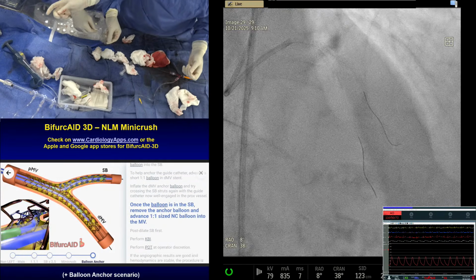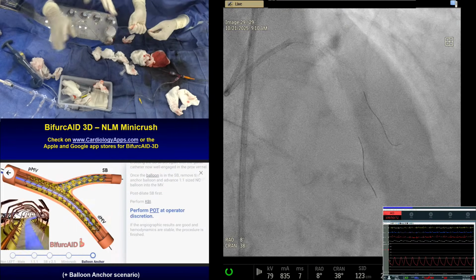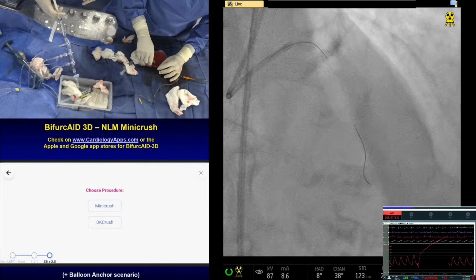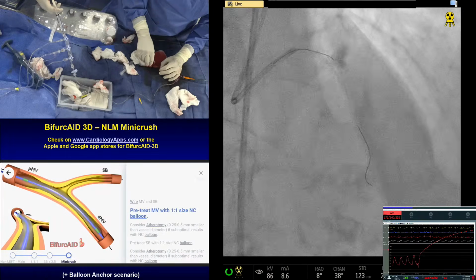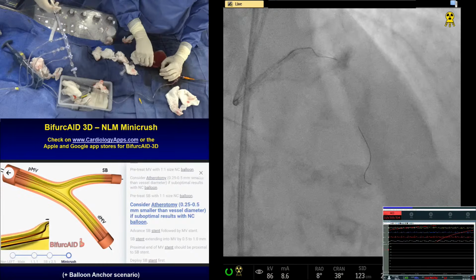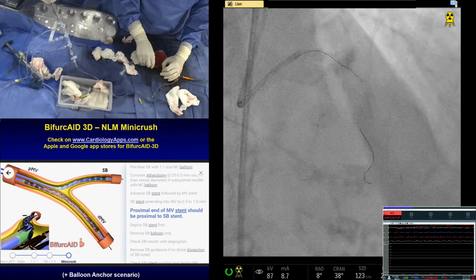Okay, this is, high pressure? So we want to just take a picture so that while you're optimizing, then you'll do IVUS once we are ready. Meanwhile, your wire has come back. DCB time. You start your lecture.